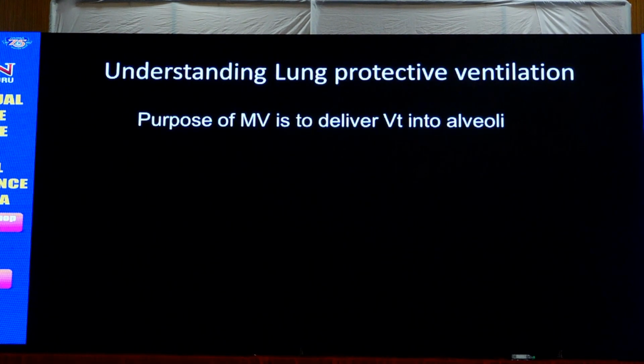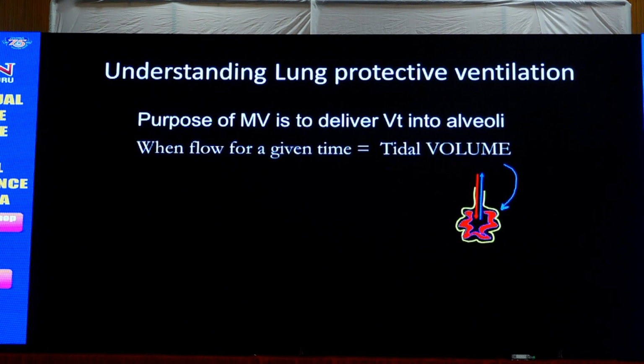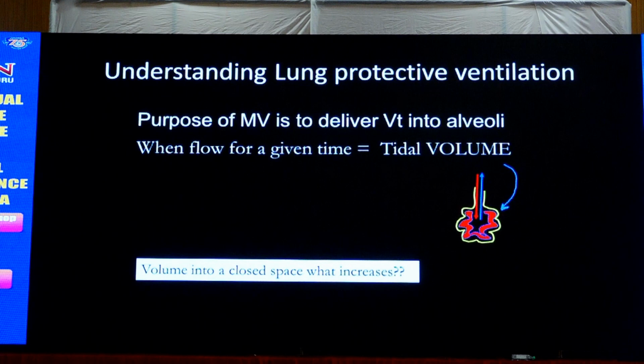So the purpose of mechanical ventilation is to put a tidal volume into the alveoli. And this I have already told. When you put volume into a closed space, because the alveoli is a cul-de-sac, what increases? Pressure.